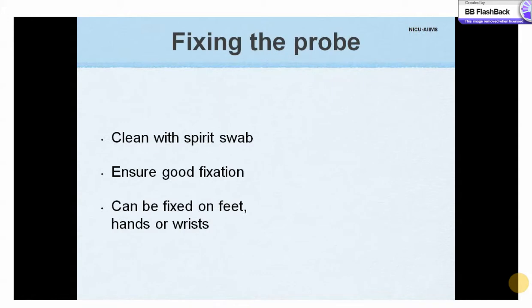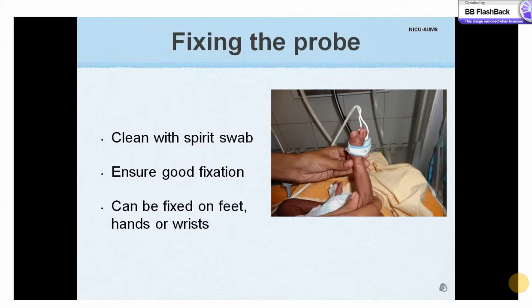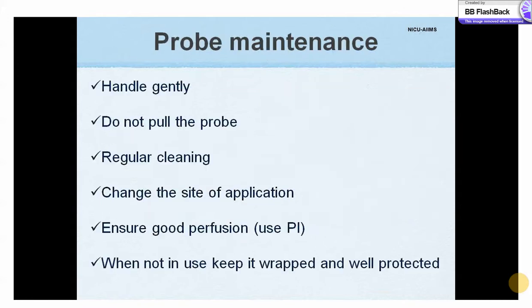Whenever a probe is applied for the first time, it has to be cleaned with a spirit swab. It then has to be secured so that one end of the probe is on the dorsum and the other on the ventral aspect of the monitoring site. Ensure secure fixation of the flex wrap around the site.